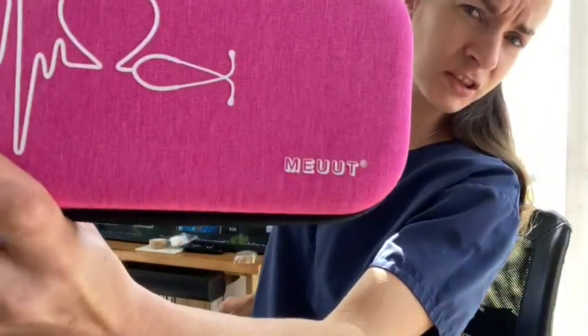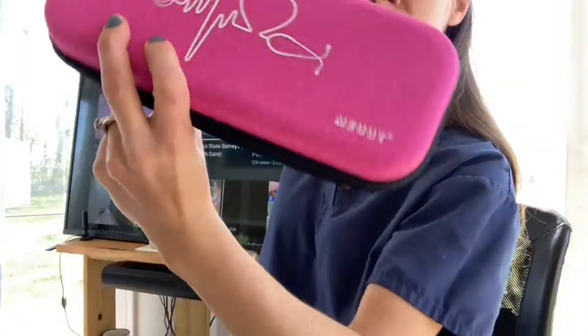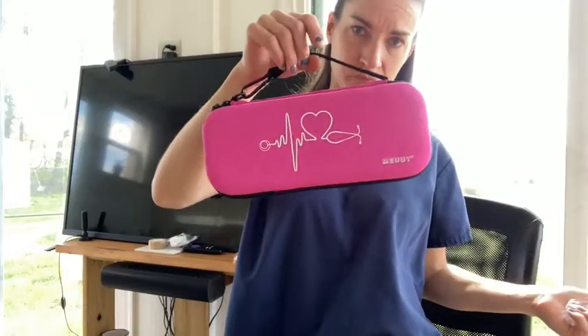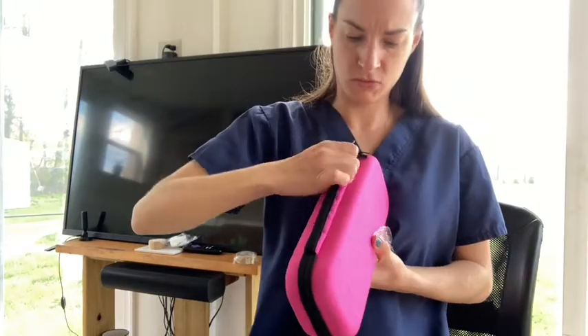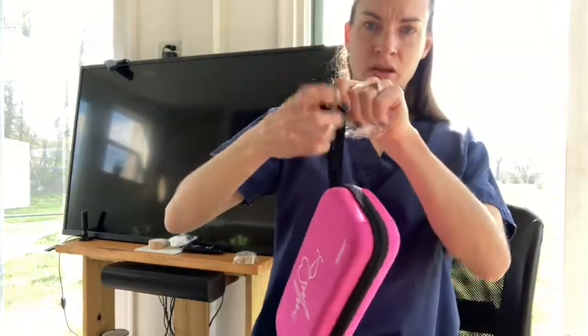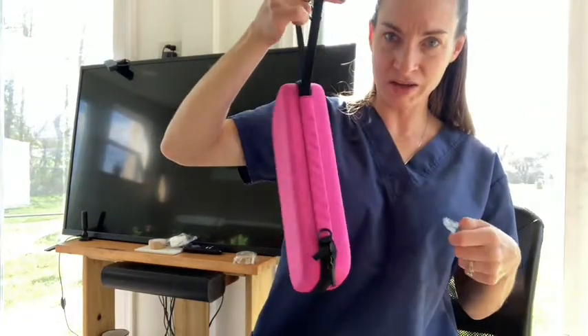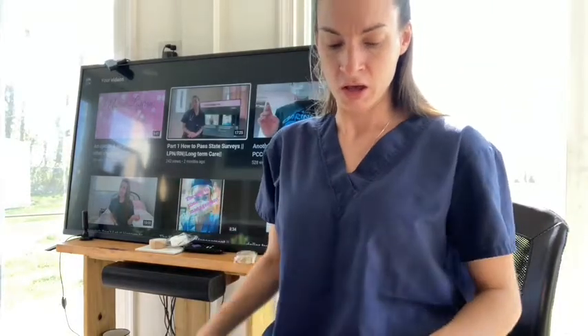The brand is M-E-U-U-T. It does have a little handle here and you can unhook the handle and carry it like that too. I just wanted to show you guys that.